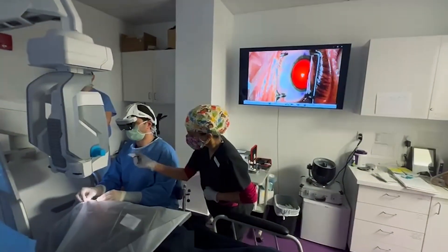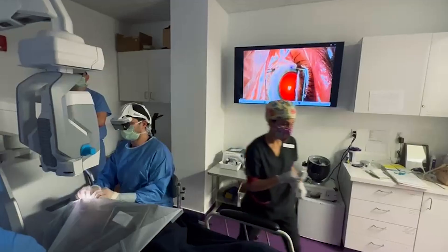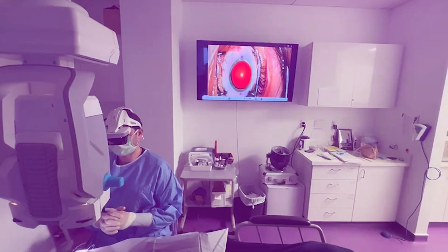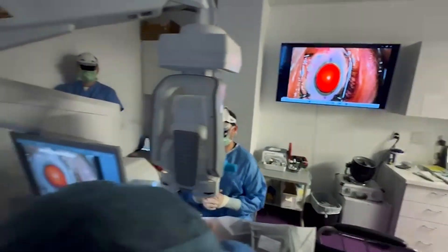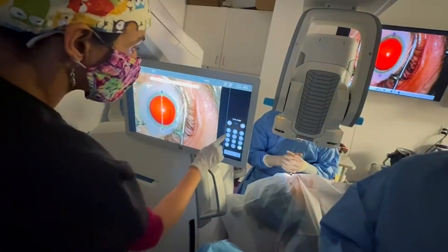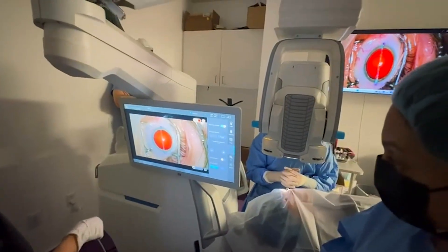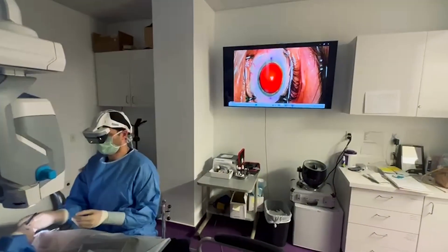Proper positioning is so important for surgery. You really want to make sure you're comfortable and that you can see everything you need throughout the entire process. It's a great view of the cornea. You can see the circulator here getting the axis of the toric alignment set. This is a toric lens, so it's designed to treat not only nearsightedness or myopia, but also astigmatism.